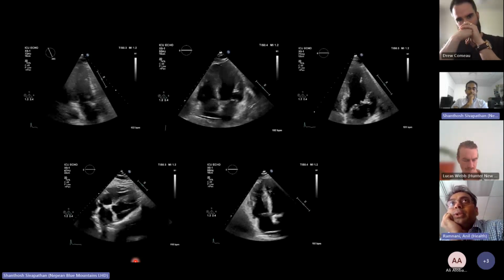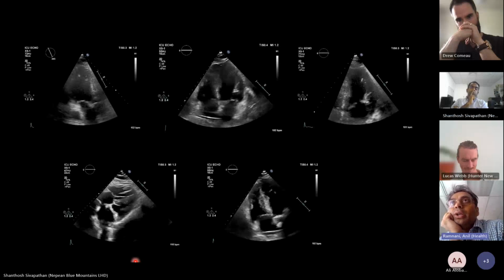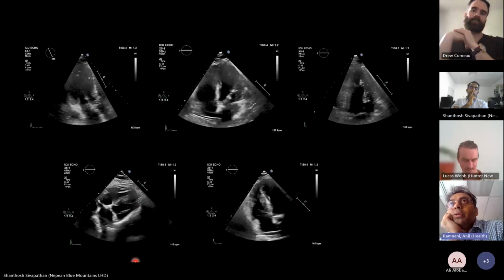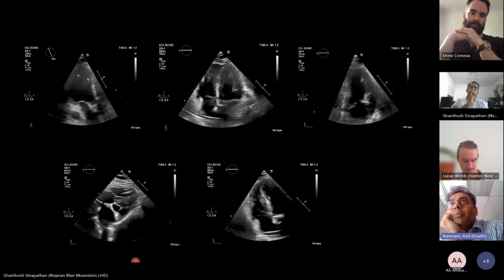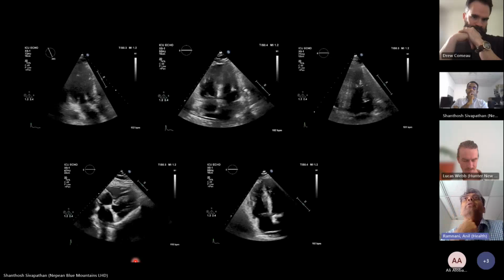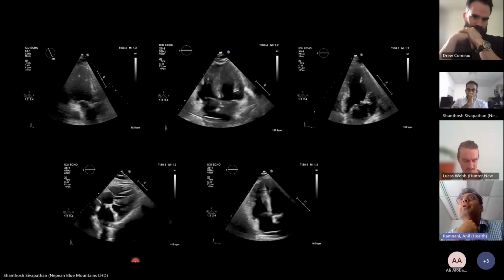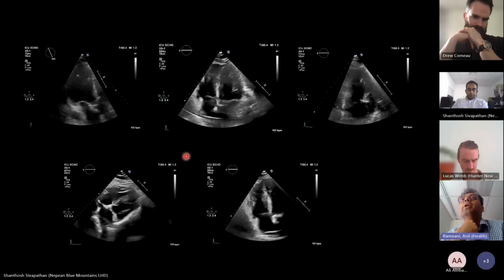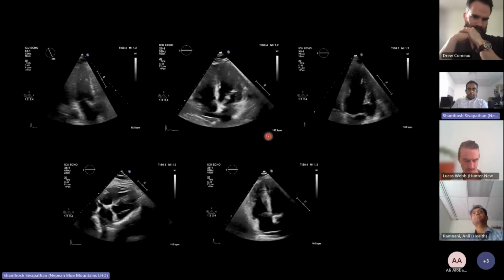Don't know the TAPSE. Doesn't look like the TAPSE is great, and the longitudinal contractility seems to be compromised. So my money is on the right heart failure or underfilled LV because of some bleeding issue or inadequate resuscitation. Yeah, absolutely. And I think I agree with you.